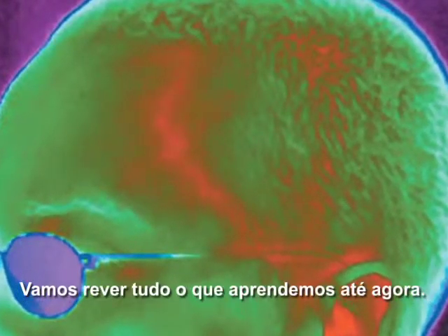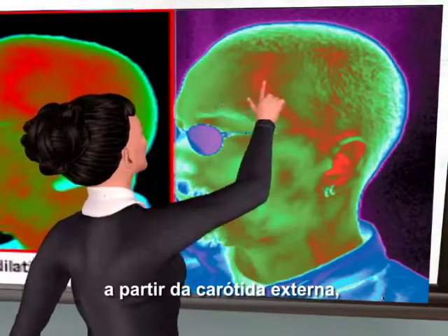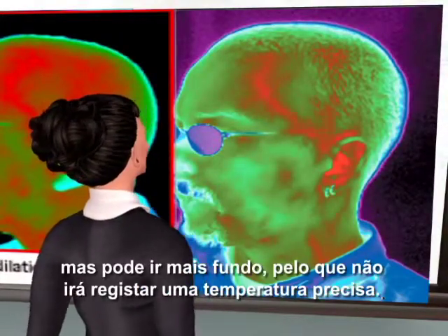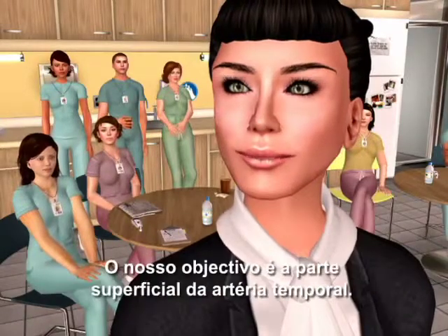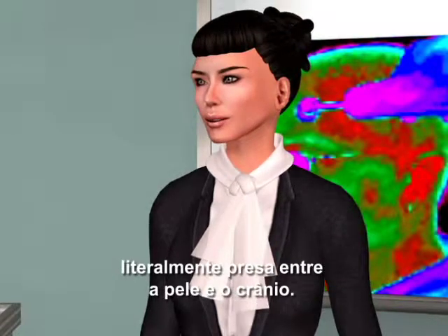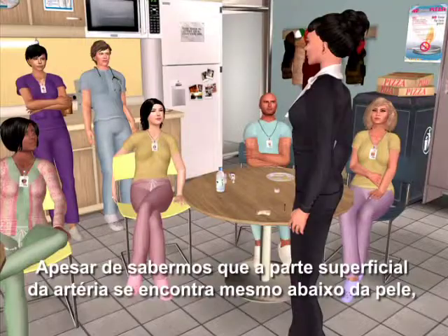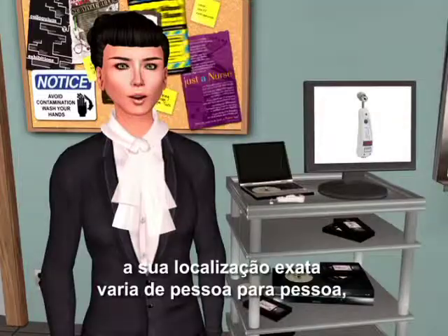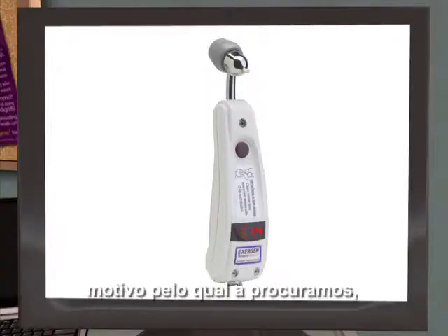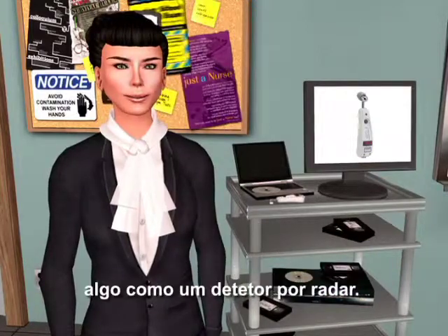Let's review what we have learned so far. The temporal artery comes up from the side of the face from the external carotids, but it can go deep and won't register an accurate temperature. The superficial part of the temporal artery is our target, located up in the forehead, about two millimeters below the skin, literally trapped between the skin and the skull — it can't go anywhere. Its exact location varies with each individual, which is why we scan, allowing the temporal artery thermometer to locate it, something like a radar detector.